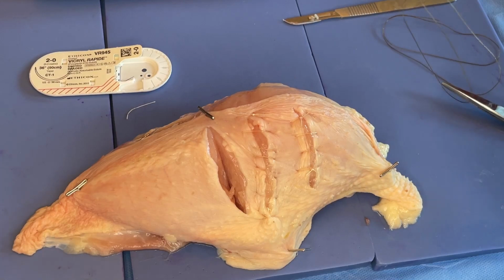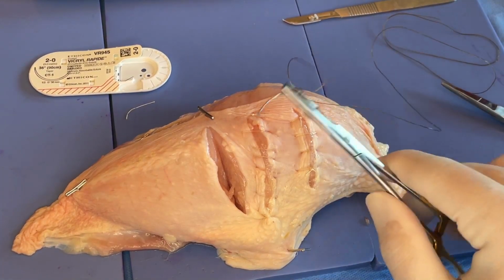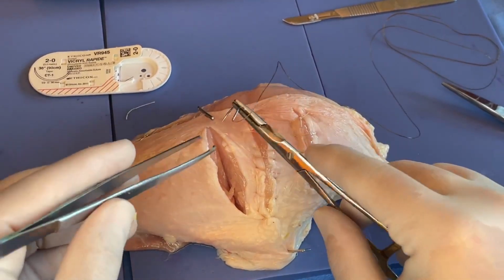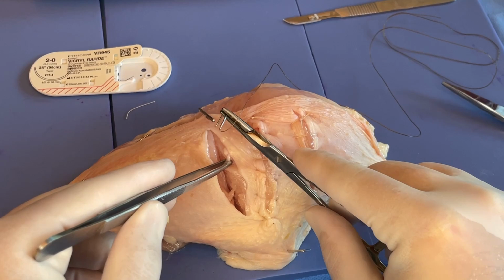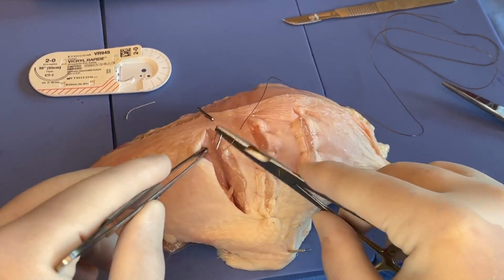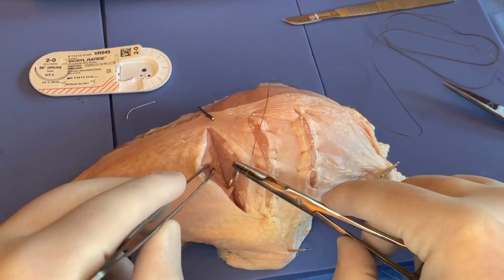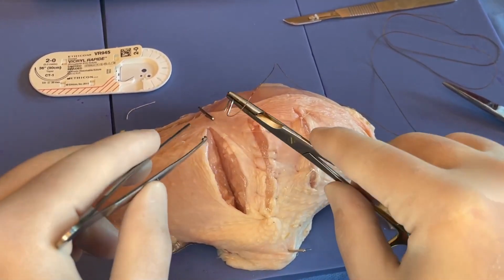All right, so running interlocking. Again, we're going to start up beyond or right at the apex of our defect because we want to get all of that divided, separated tissue compressed within our suture line.